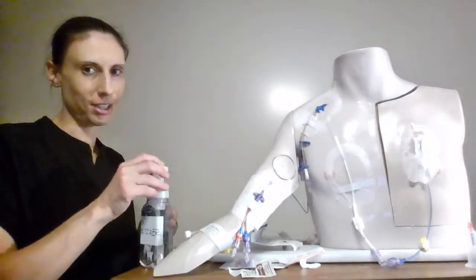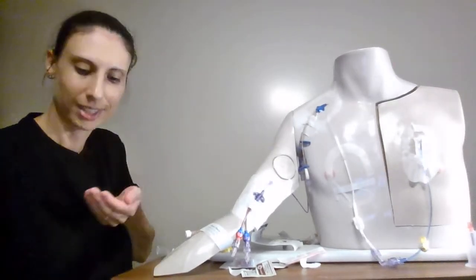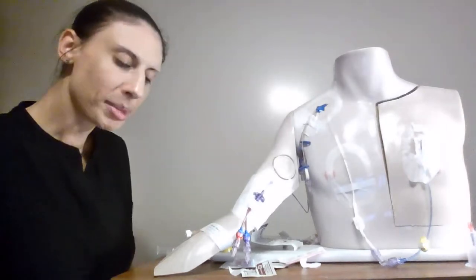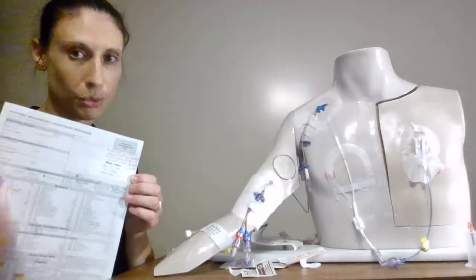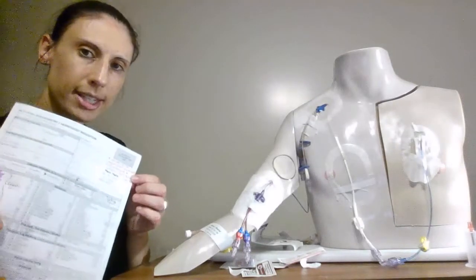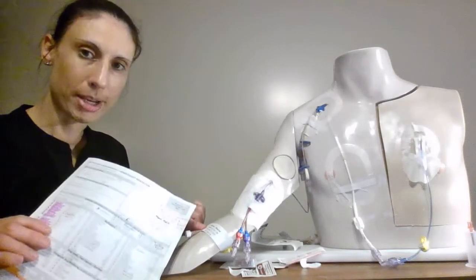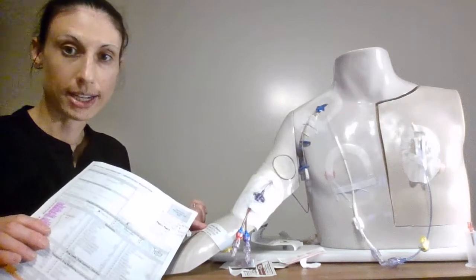So first I want to make sure of course do my hand hygiene and if I'm sending blood work I want to make sure I have a requisition that is stamped appropriately and also filled out appropriately and I want to make sure that the stamp or the addressograph matches my patient's name band and also one other identifier.